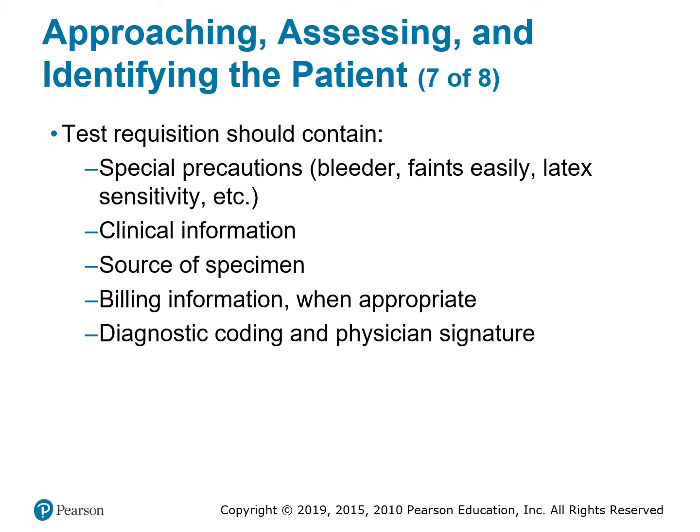When they say source of specimen, sometimes they may want serum and they want plasma instead of serum. And what we mean by serum and plasma is the different color tube we're going to draw, which in chapter eight, we're going to differentiate in more depth. And I'll explain even further the difference between serum and plasma. I just don't want to overload you at this point. Just know that at this particular time, they mean two different things as far as the source of specimen collection.